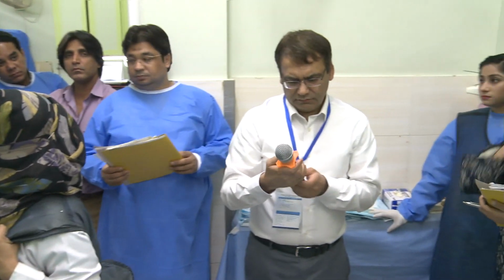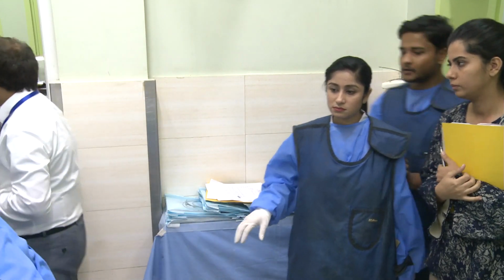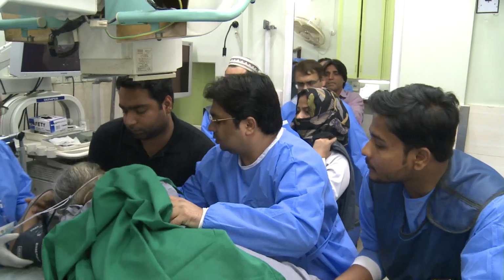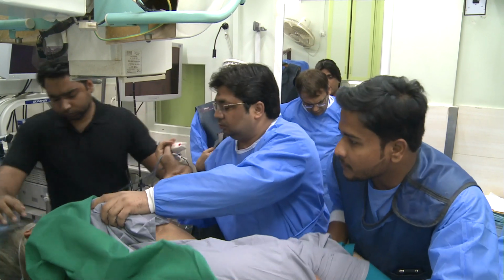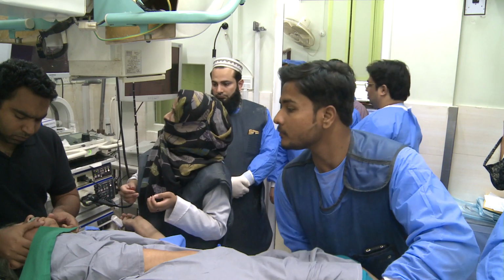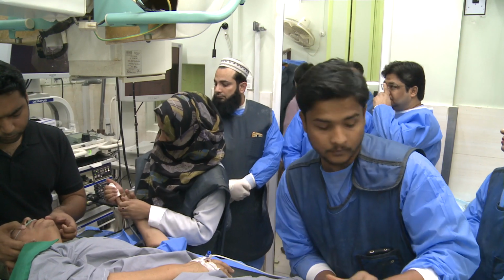Okay, let me tell you, this is an interesting one. So before we start, this patient was referred to us. She's got abdominal pain, normal LFTs, ultrasound showing CBD dilatation, MRCP showing CBD dilatation till the distal end, no stones. I did an EUS and I saw a dilated CBD, but no mass. How old is she? I can't remember how old, but she's middle age for sure.